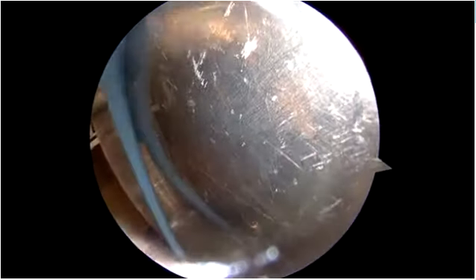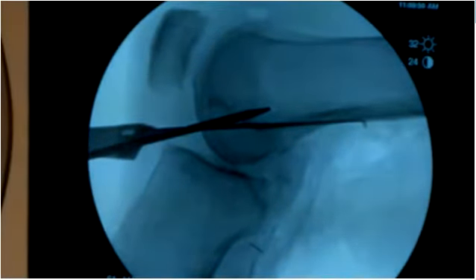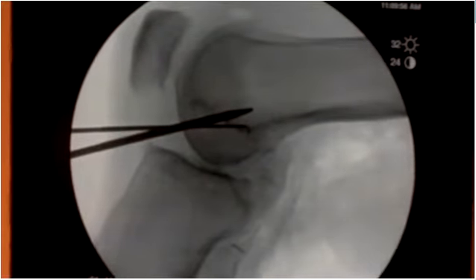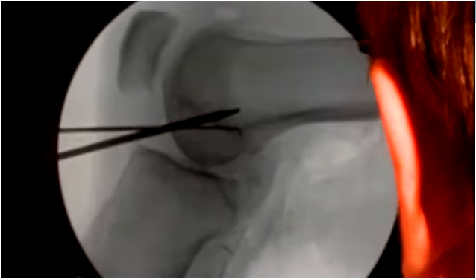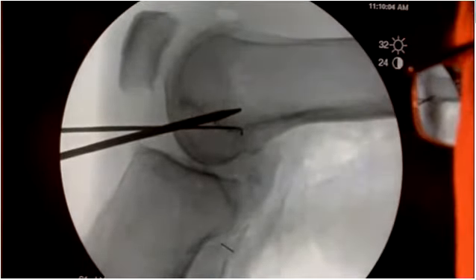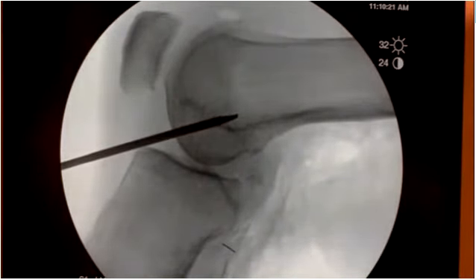So as I told you before, the points which we need, or the lines which we need, again fluoro, please, is the posterior cortex line here. Then we need to do another fluoro, please. The posterior part of the Blumensaat line, which would be around here, and the posterior part of the condyle, which is of course difficult to find here because of the osteophytes. And then it's just above these intersections that you would put the MPFL insertion on the femur. Fluoro. So you see that's where I would put it more or less.